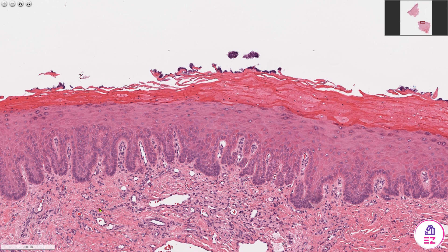When we look at this epithelium, hopefully you can appreciate that the degree of keratin is increased, so there's an element of hyperkeratosis here. But the area of interest is really the lower two-thirds of the epithelium, this kind of zone.